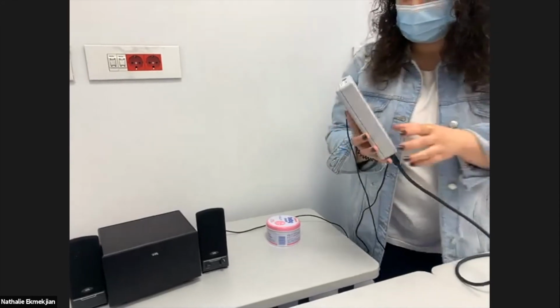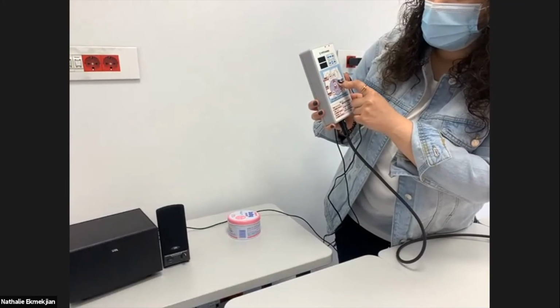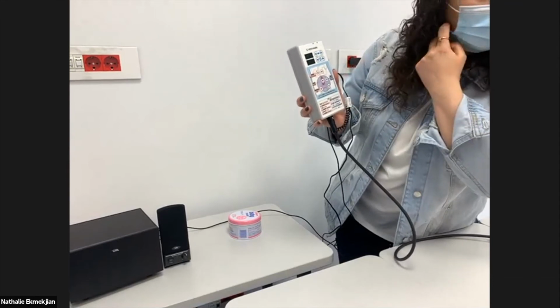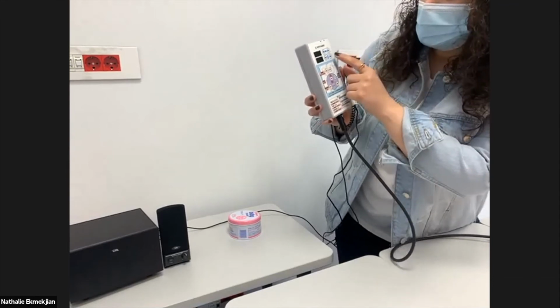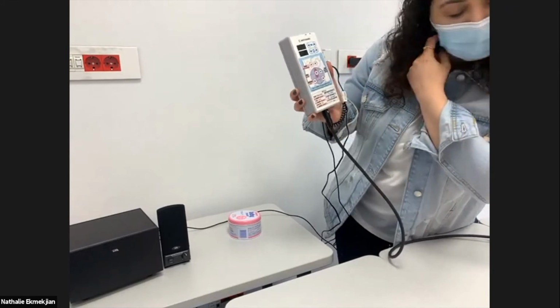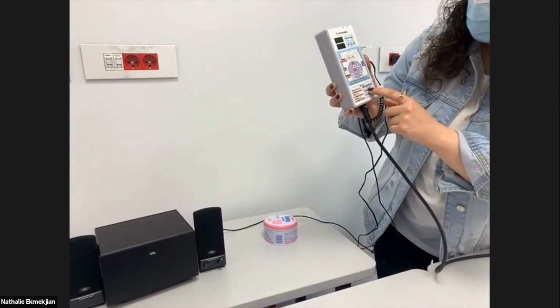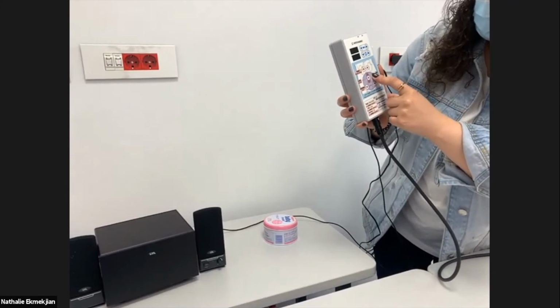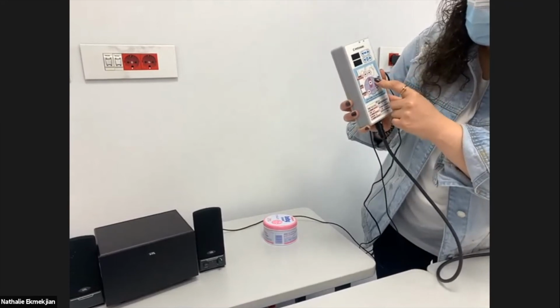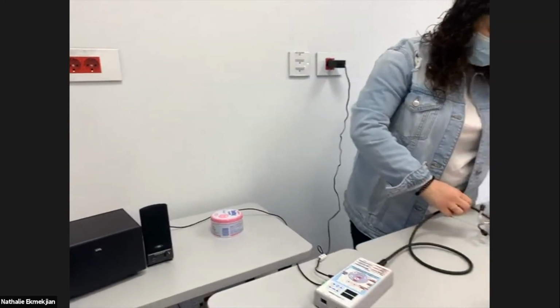So how we can auscultate? I want the bowel. I press on it 2 seconds. This is by default the sound, and this is, we can change the number of cases. I want it increased. I click on this button, the case number 1. We see it here, the case is number 1. Okay, so I press it again 2 seconds, 1, 2. It comes with these lines. Press the green button, and now ready to auscultate.